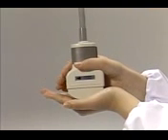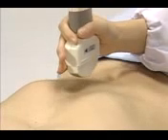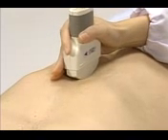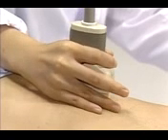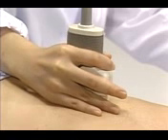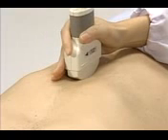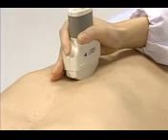The sonographer holds the probe with her right hand, places it in close contact with the patient's skin, then starts the examination. Hold the probe firmly with your thumb, forefinger and middle finger. Place the ring finger and the little finger on the patient's skin to support the probe. Be sure to hold the probe firmly, as if it were part of your hand.